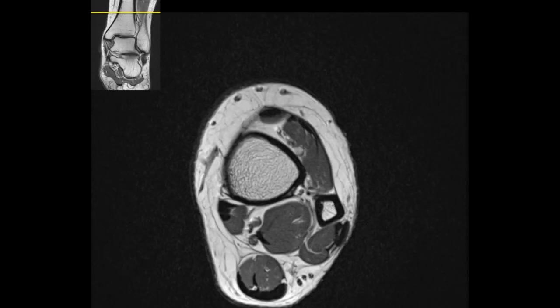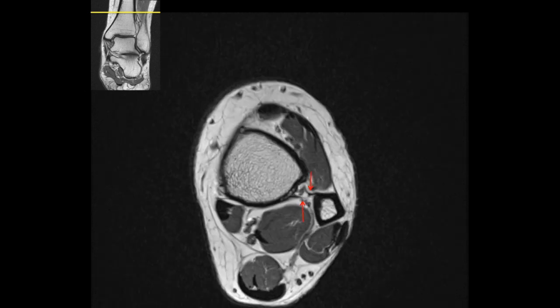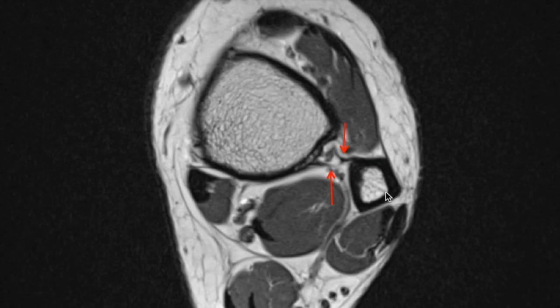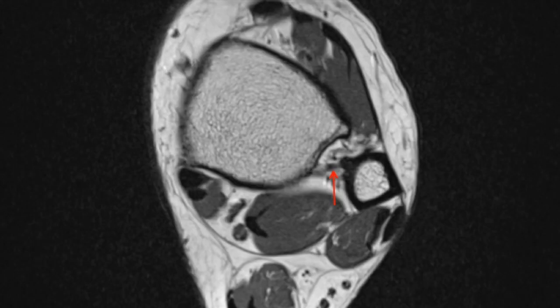Now we look at the axial images, going from superior to inferior. First we look at the bones — the larger bone in cross-section is the tibia and the smaller one is the fibula. The cartilage and joint are not well seen on axial images. Next we look at the ligaments. As you go from superior to inferior, you can see thin flimsy hypointense bands coming from the tibia and going obliquely towards the fibula — these are the syndesmotic ligaments.